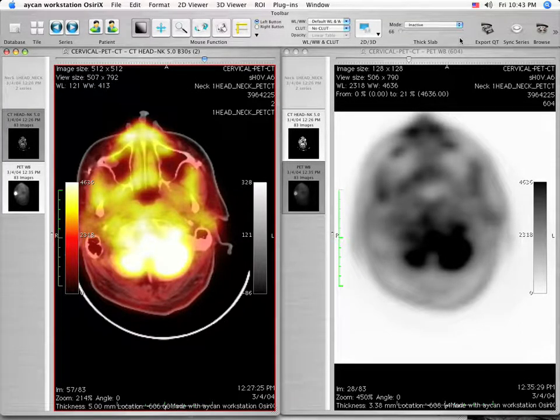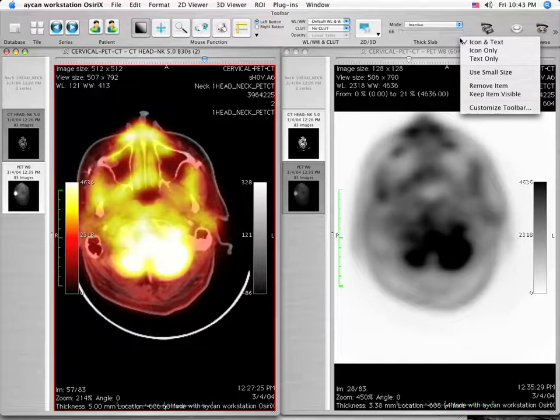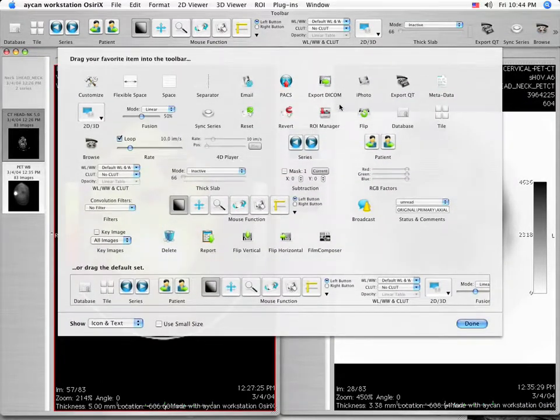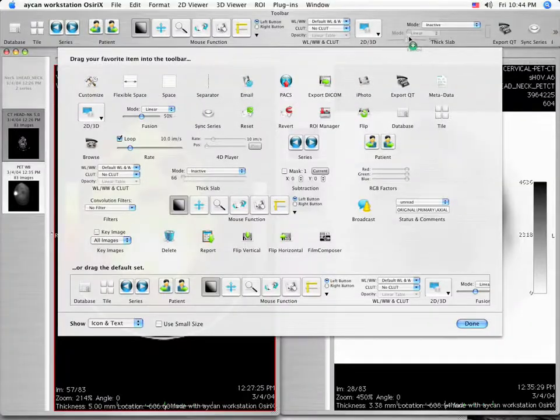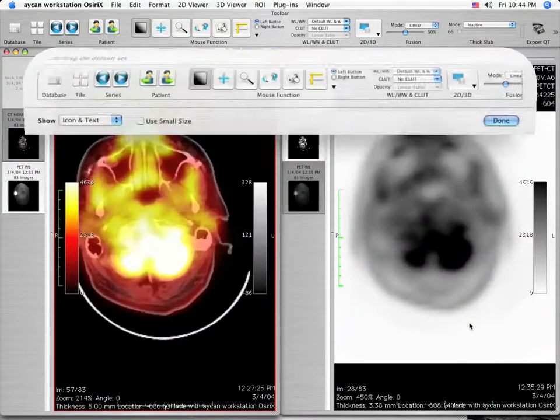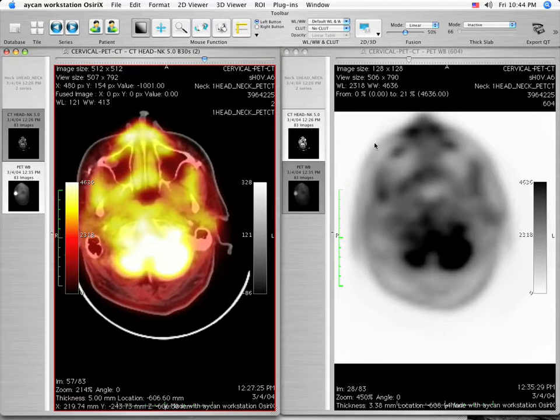In order to control the degree of transparency or overlay in the fused images, we will need to utilize the Fusion Control tool. Right click on the toolbar and select Customize Toolbar with a single left mouse click. Drag the Fusion Tool to the upper toolbar, then single left click on Done to close the Customize window.